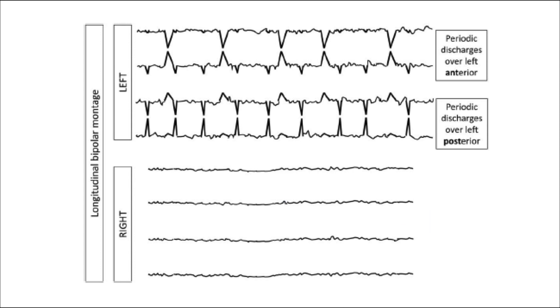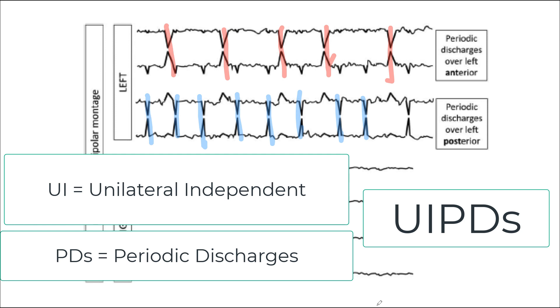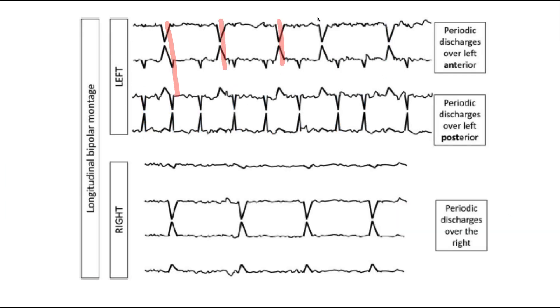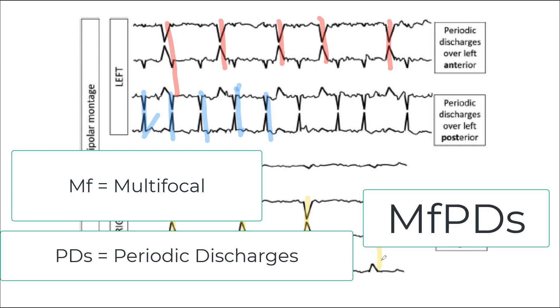Here is an example of discharges occurring independently in two different regions but both in the same hemisphere — left frontal indicated in red, and a second set in the posterior head region indicated in blue. Because they are clearly independent, we call these unilaterally independent, or UI, periodic discharges — a new term in the 2021 nomenclature. When a third independent focus exists in the right hemisphere as well, we use the term multifocal or MF, giving us multifocal periodic discharges, or MFPDs.